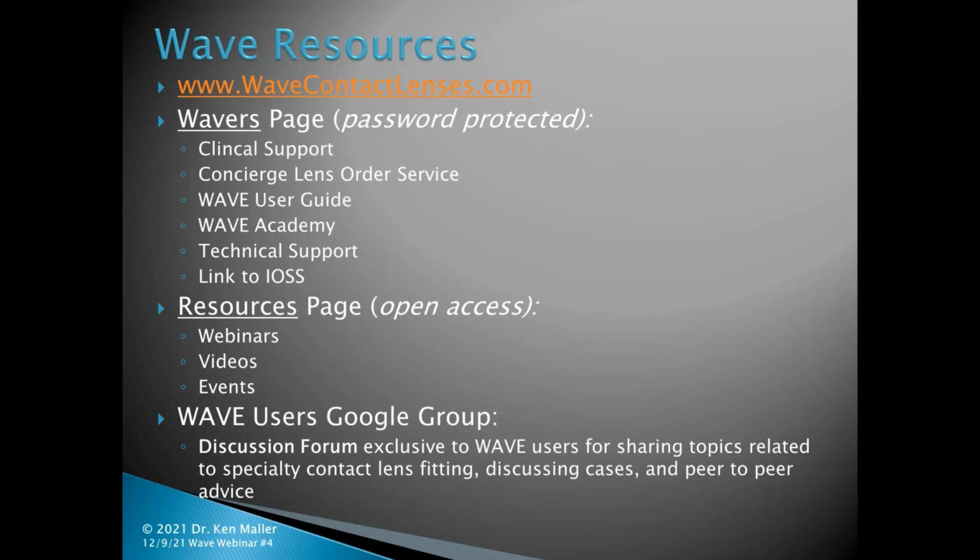Perfect. That was a lot of excellent information. And it's always important to remember that each case is different and requires listening to your patient's needs and how they interact with their own lens.